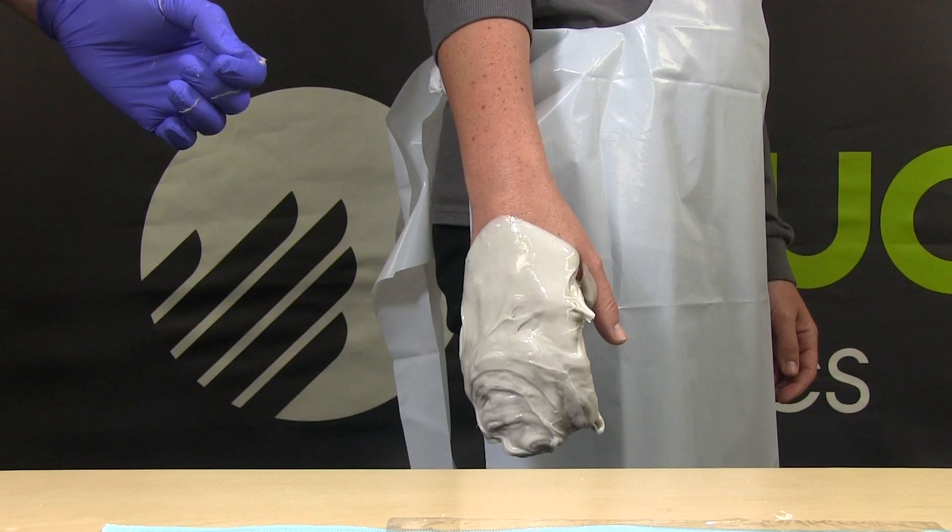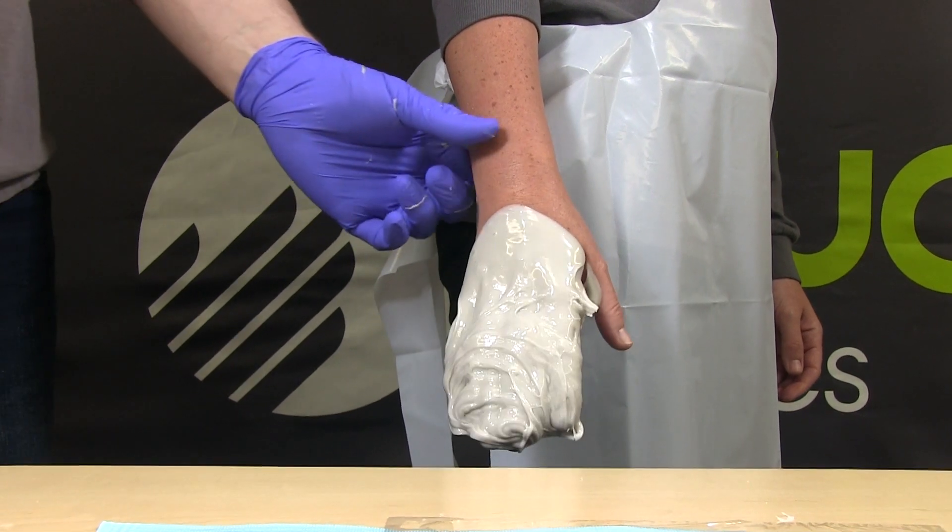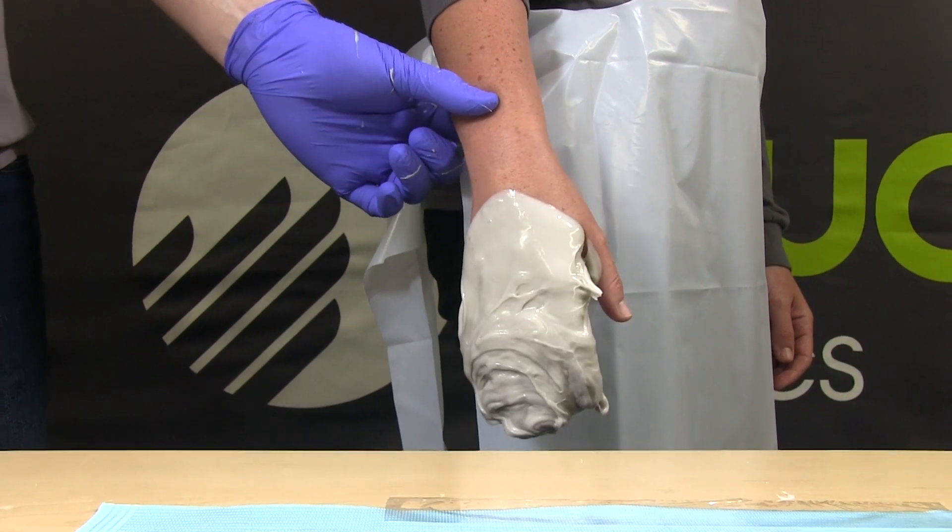With the customer in a relaxed standing position, wait approximately 3 to 5 minutes for the impression to cure completely. Pressure may be applied to the wrist to relax the customer's hands and fingers.